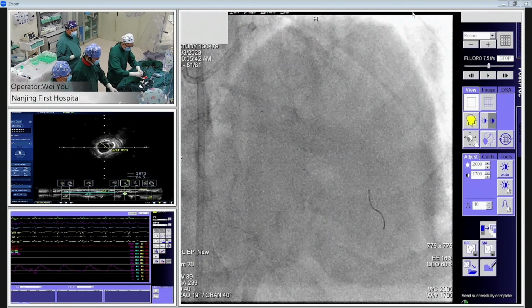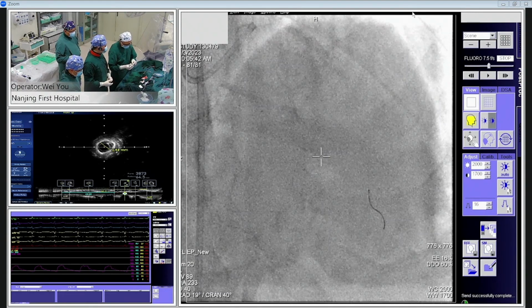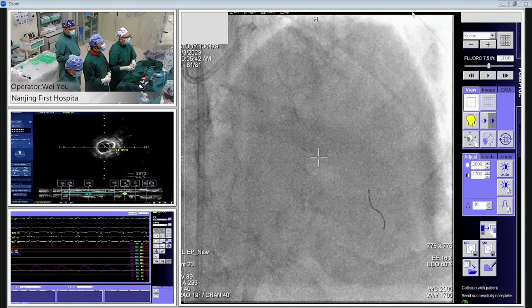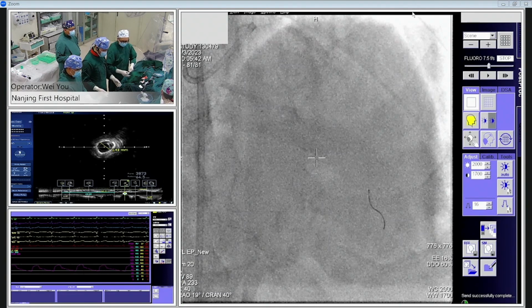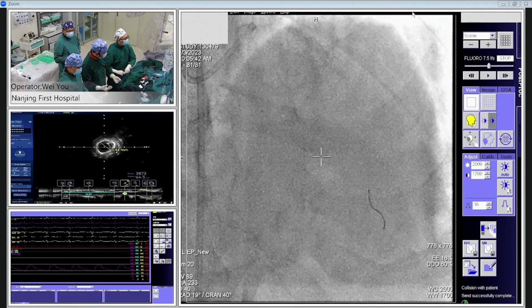Okay. For these scenarios, consider very long lesions, what do you think? Will you use only a workhorse wire, or will you use some stiffer support wire? Okay, support may be better because after all, it's a long lesion and with the angulation. Extra support wire, please. Extra support. SLAM wire, yeah.